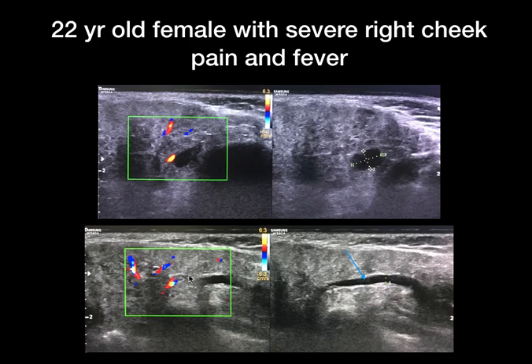On color Doppler, there is increased vascularity. Anterior to the parotid gland, you can see a dilated parotid duct which was more than 2 mm in size.